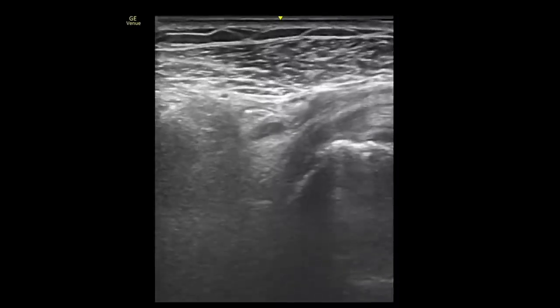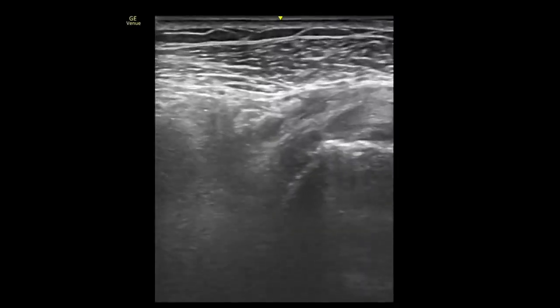The quality of the movie image is bad. Please understand that these patients are elderly and unable to rotate their arms appropriately. However, the results have proven to be good for these patients.